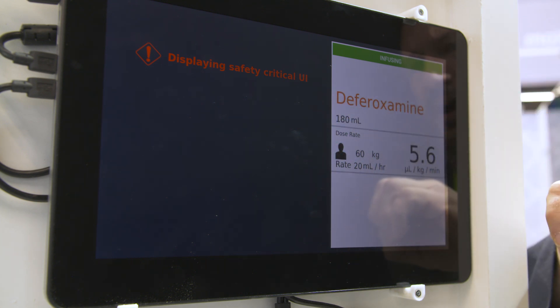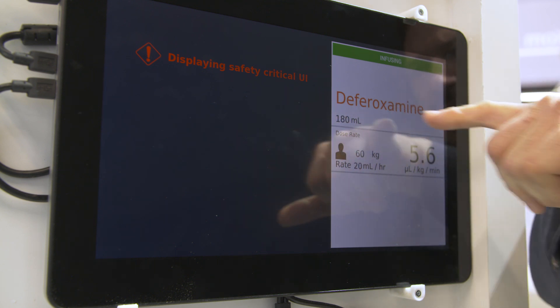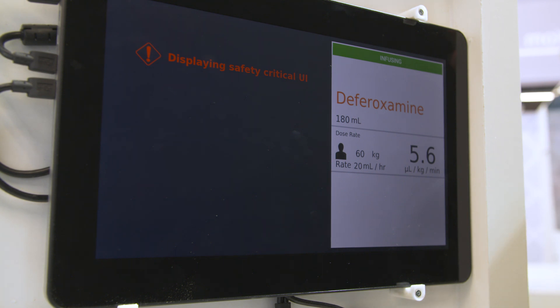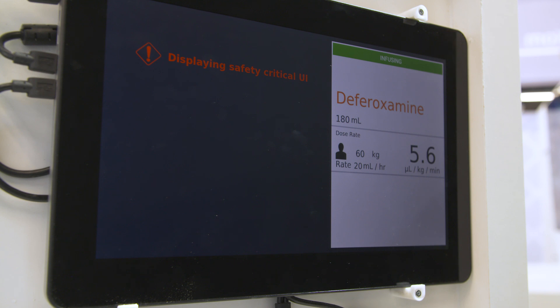The information displayed here is what we defined as safety-critical. The safety-critical information is both accurate and still being displayed despite a failure in the software.